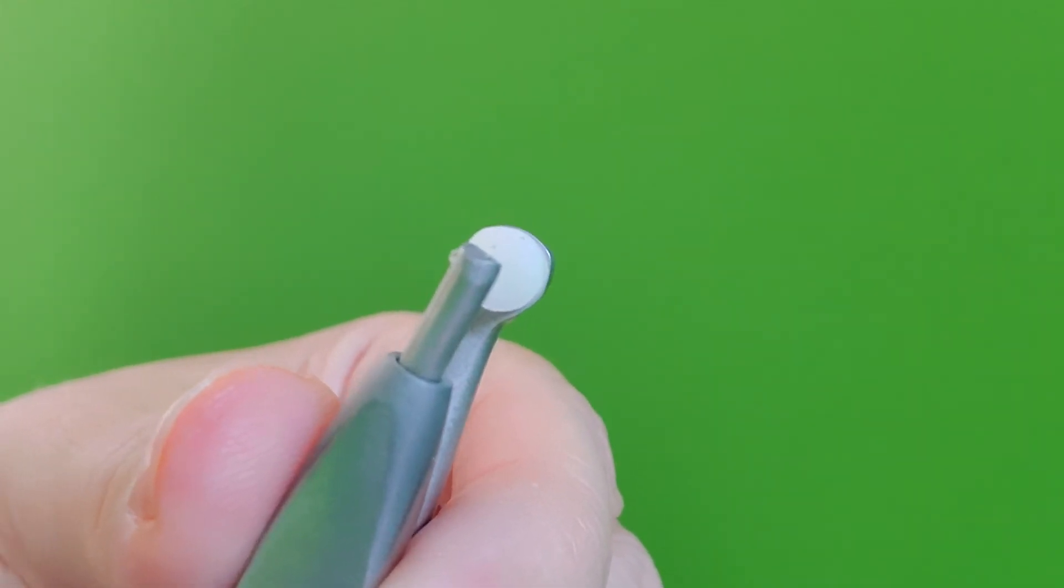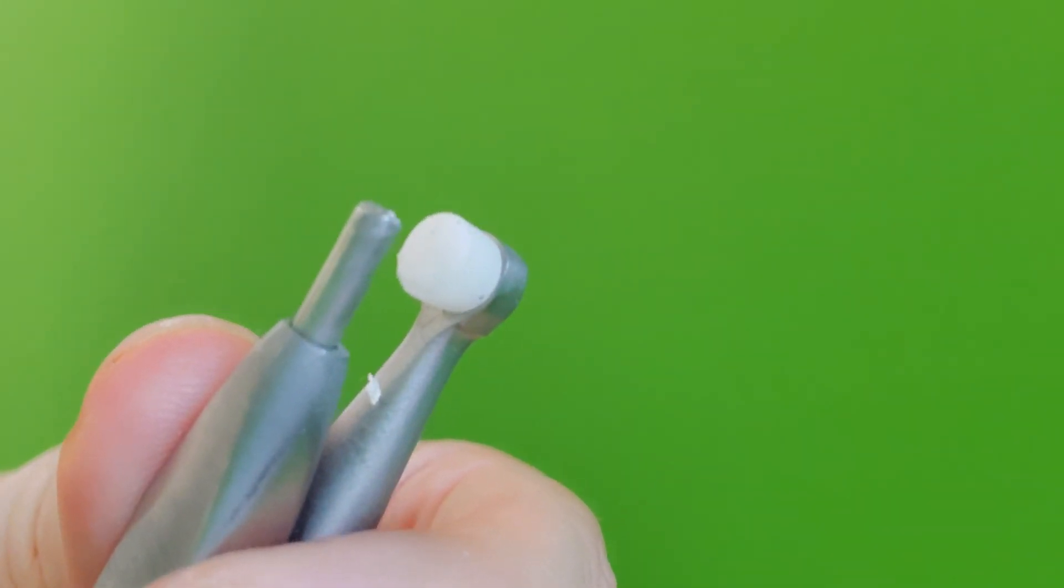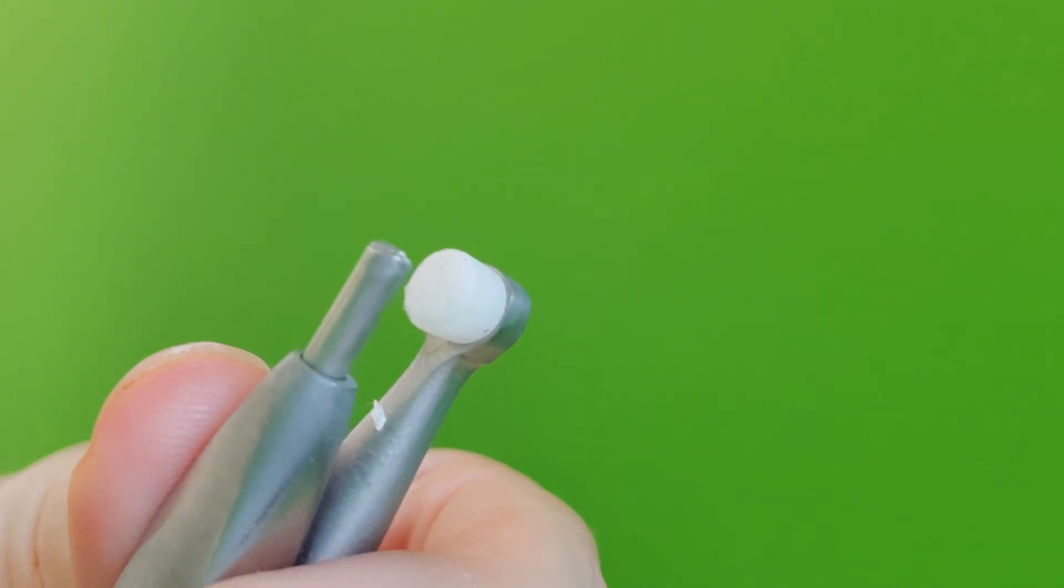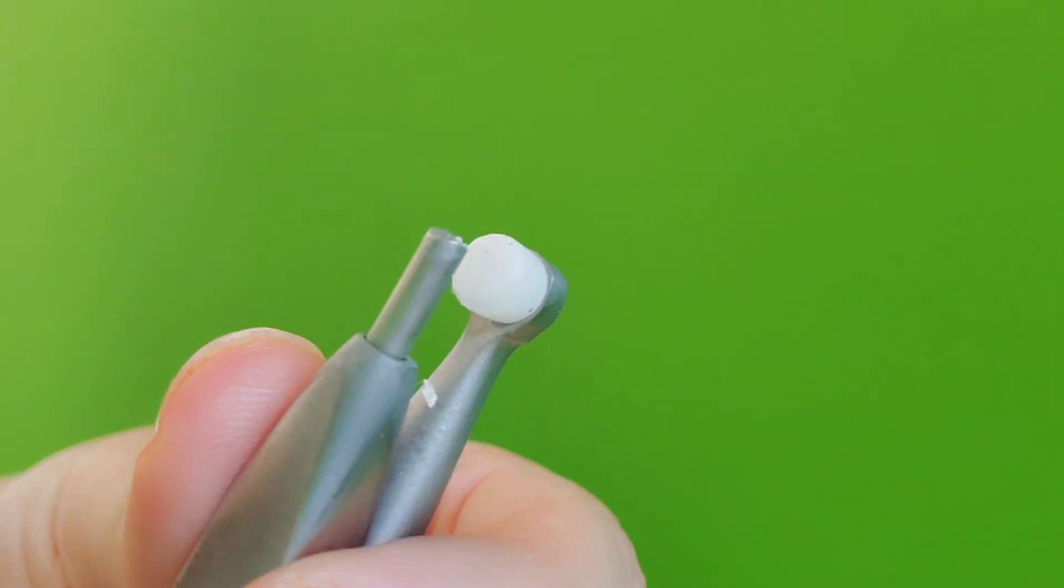I would definitely invest in one of these suckers. It's so much easier than using a burr. All right, thanks so much.